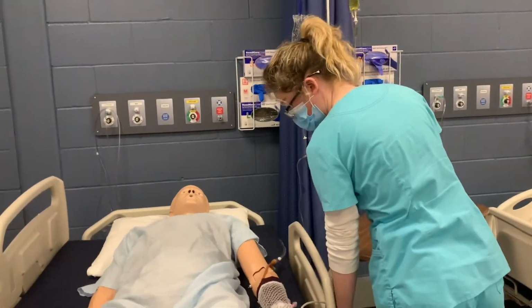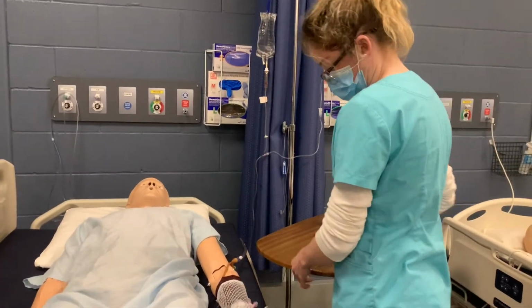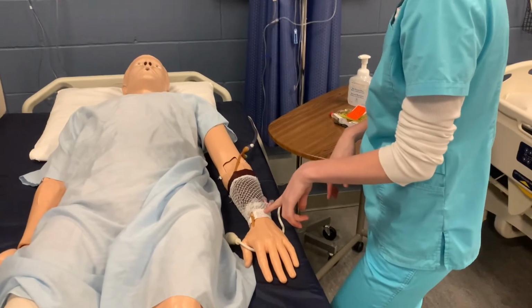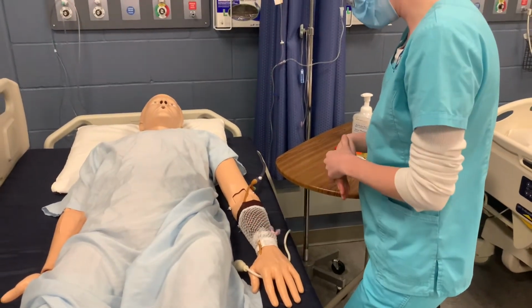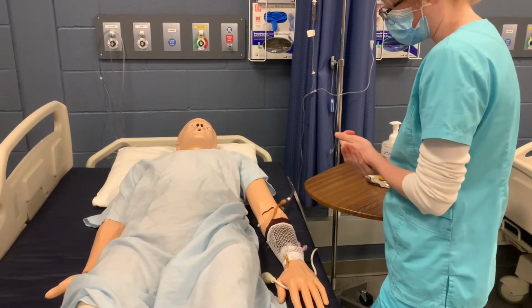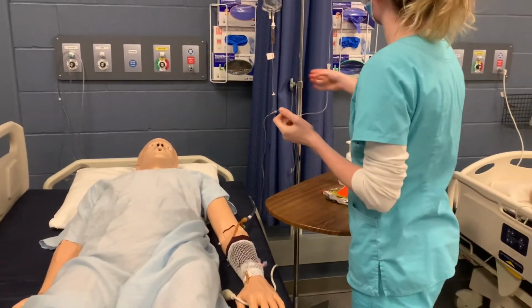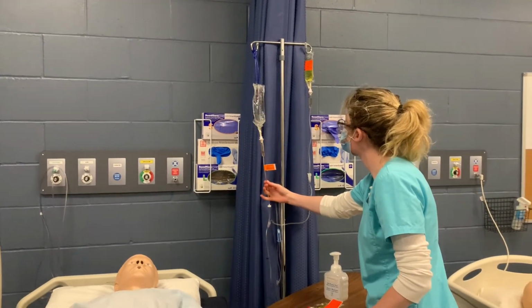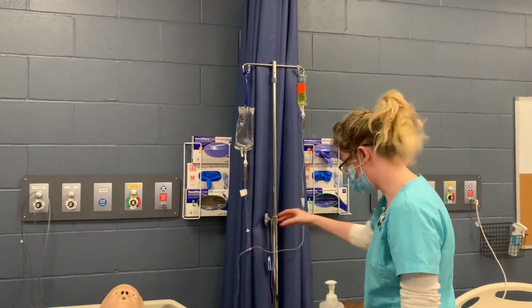Okay. Now I'm going to inspect the site. I'm looking for any redness, edema, and any signs that the IV is misplaced, but it appears to be in perfect condition. I'm also checking the IV bag here. It is not expired, and there are no bubbles in it, and there are no cakes or anything.